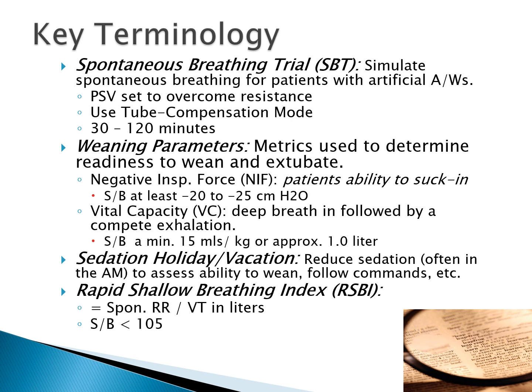If you recall, resistance is the difference between peak and plateau pressure divided by inspiratory flow in liters per second. So if you calculate that the resistance is somewhere around 4 or 5, you could dial in 5 centimeters of pressure support ventilation, and it would simulate or closely emulate a spontaneous breathing patient.